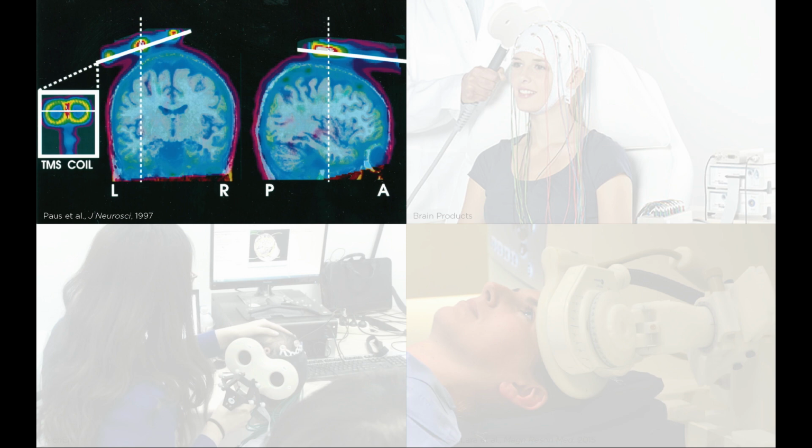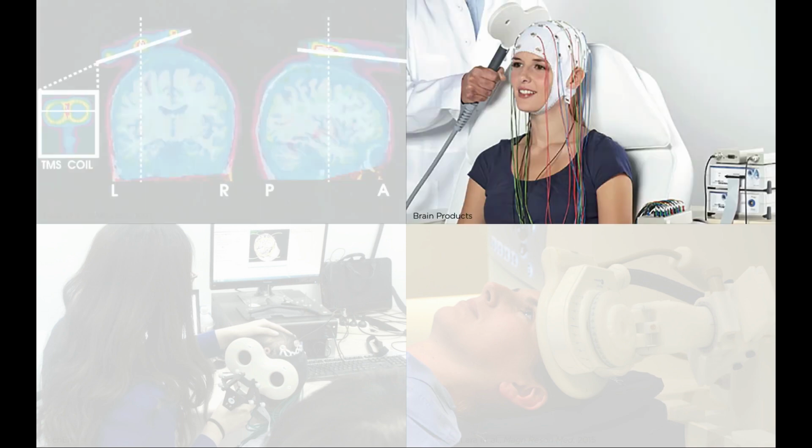The only thing you have to be careful of in terms of safety and equipment is that you might have to shield the photomultipliers so that it doesn't get damaged by the high magnetic field of the TMS. So one can do TMS PET easily. A second technique that people are doing more and more these days is a combination of TMS and EEG, and there are several safety features related to that. One is induced heating in the underlying EEG electrodes.